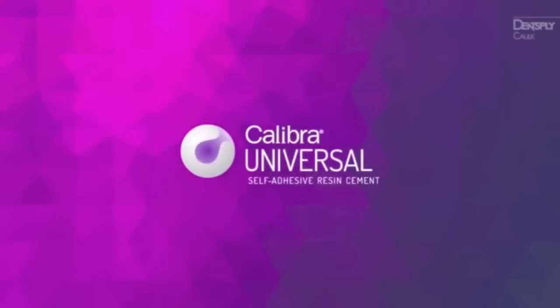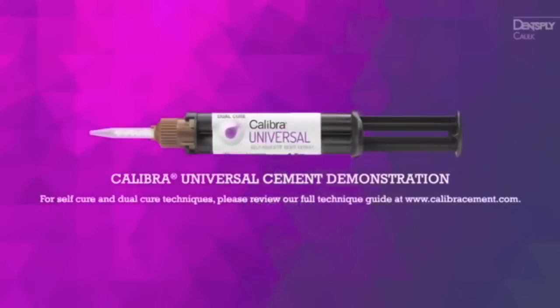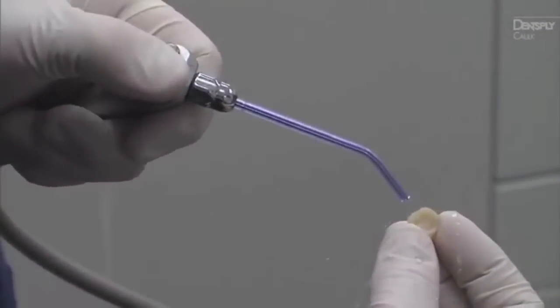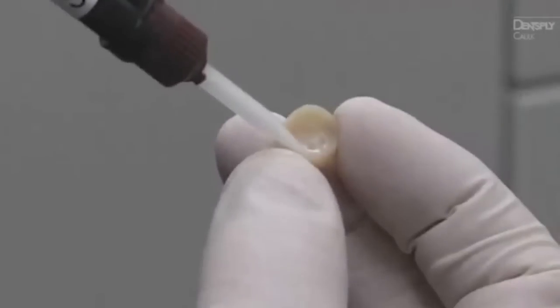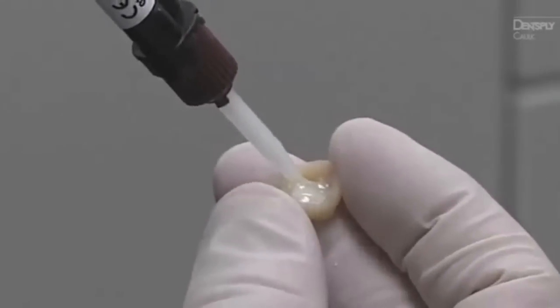With Calibra Universal Cement, excess cleanup is now a snap. To start, clean and dry the restoration. Discard a small amount of material and attach the mixing tip. Apply a thin, uniform layer of Calibra Universal Cement to the entire internal surface of the restoration.